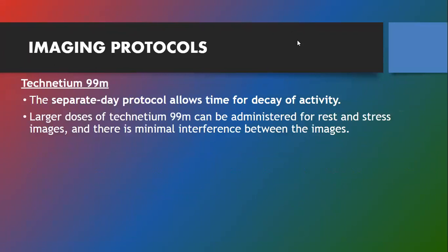Okay, if a patient is quite obese and imaging is not good, then we can utilize a separate day protocol as well, in which, both at rest and in stress, we are going to inject a higher amount of isotope to improve the imaging in such patients. If an obese patient has unclear images, then a 2-day protocol can be utilized. Commonly, technetium scanning is done in a single day.